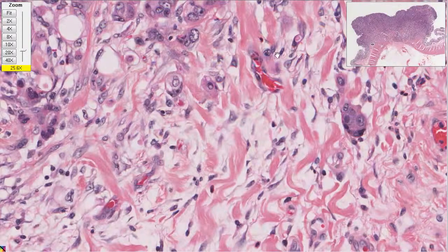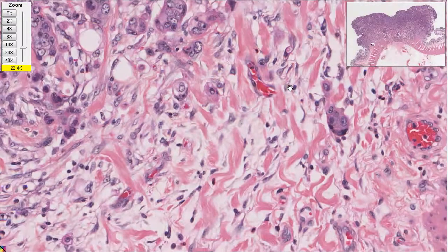So this is actually, I can never say the word, metastasis. This is it. We're seeing it. This is where it would come from. This is where it's starting to happen. So these guys are the bad actors. They're growing in next to these very fragile little blood vessels, and so that guy is knocking on the door. Once it gets in here, that's a venule, meaning a little vein. That's the road out.